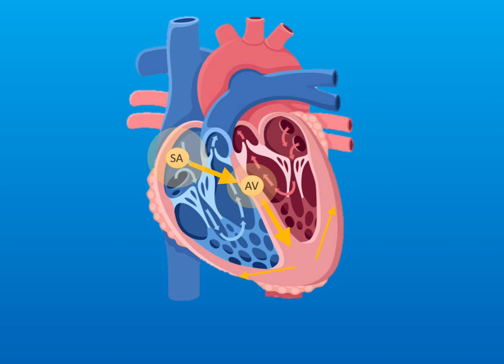In the case of a wide complex tachycardia, in a ventricular tachycardia for example, the source of the impulse is in the ventricles. Maybe we have an abnormal focus within the ventricles that's firing off. So these cells have fired and sent out an impulse, but the impulse isn't connected with a fast-acting conduction system. So the impulse will travel to the other cells in the ventricles by cell-to-cell conduction, which is slow conduction. On the trace, we're going to see a wider and a slower QRS.